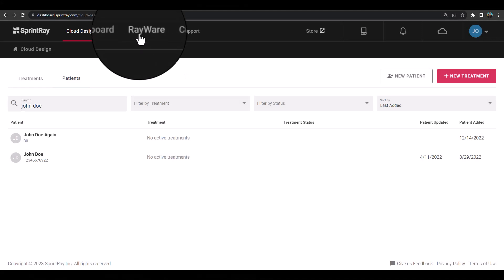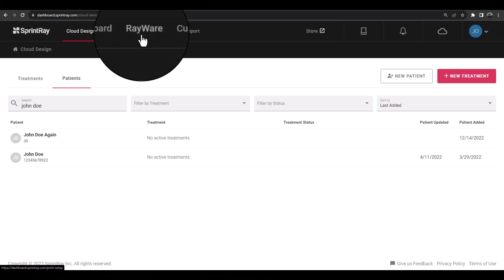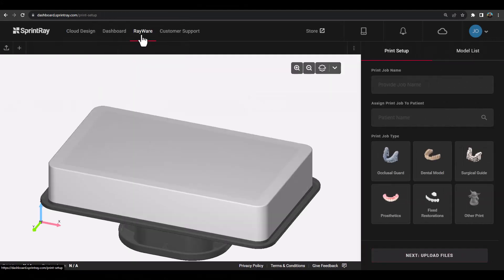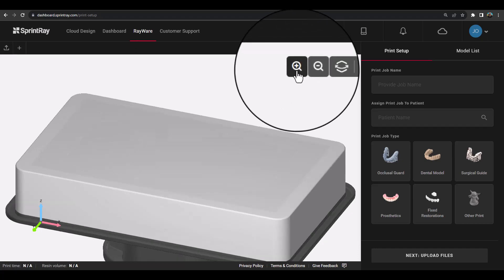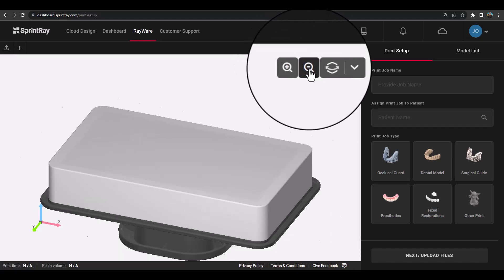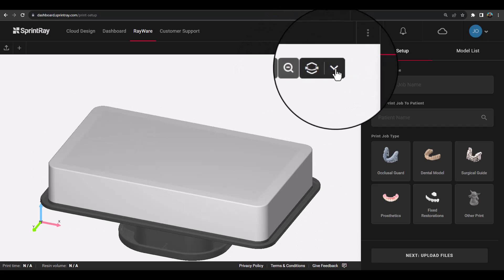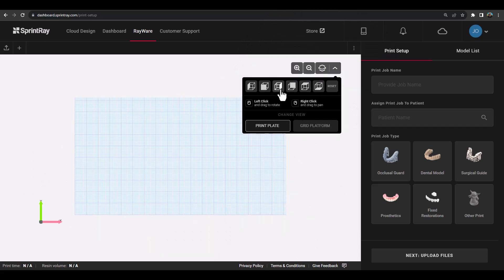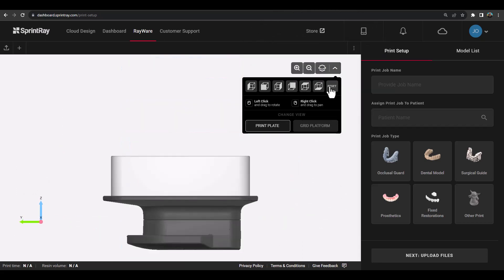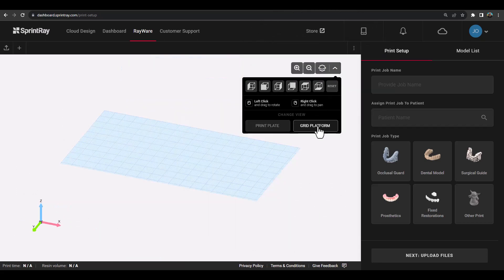To begin, log into your dashboard account and access Rayware using the Rayware tab at the top of the window. Once there, you will see a preview of the print platform and will be able to modify the view controls in the upper right-hand corner of the view window.